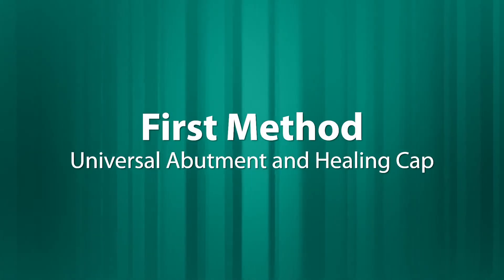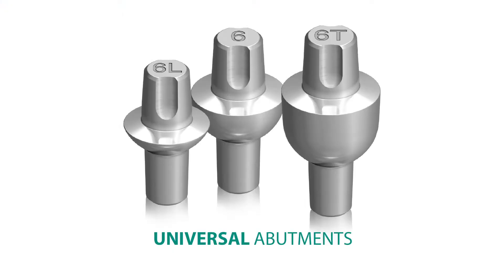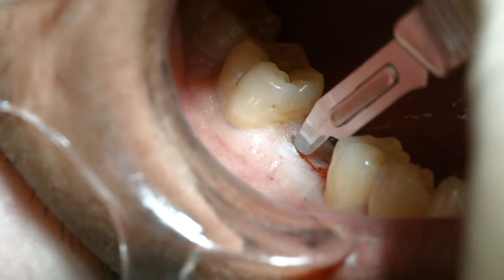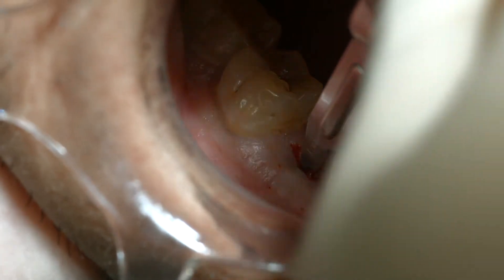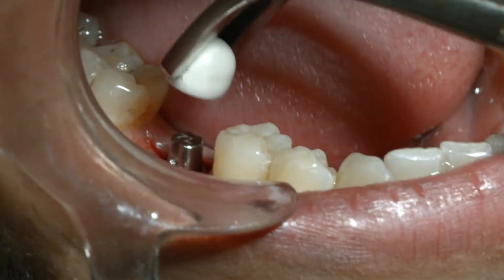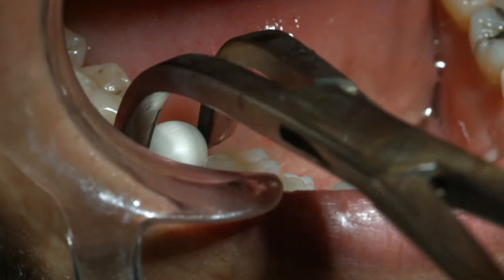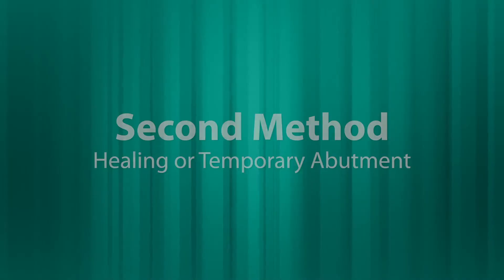The first, and probably easiest, way to do this procedure is using the new universal abutments. The procedure begins at the time of uncovering of the implant. With the soft tissue open, you can insert the universal abutment, tap it in place, snap on the healing cap or temporization sleeve, and wait for the soft tissue to heal prior to taking an impression.